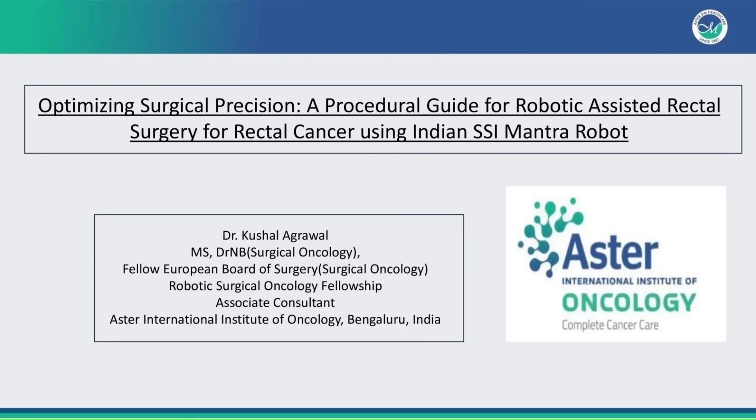Optimizing Surgical Precision – A Procedural Guide for Robotic Assisted Rectal Surgery for Rectal Cancer Using Indian SSI Mantra Robot.